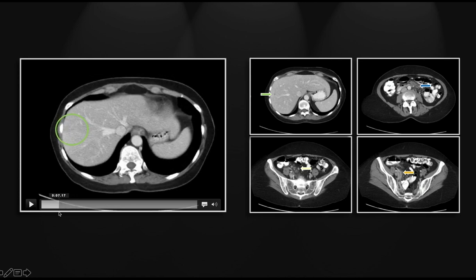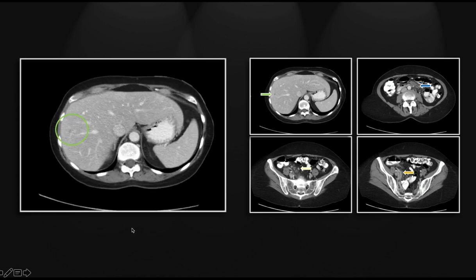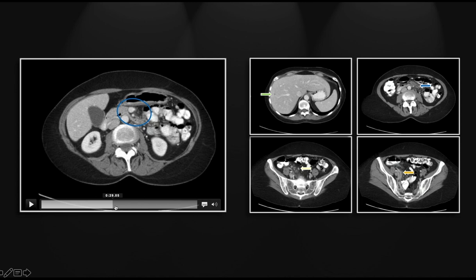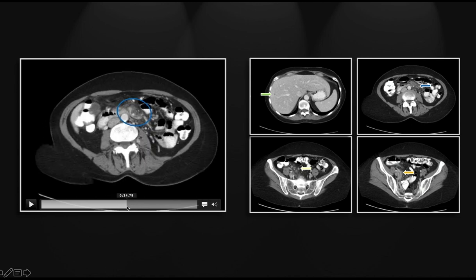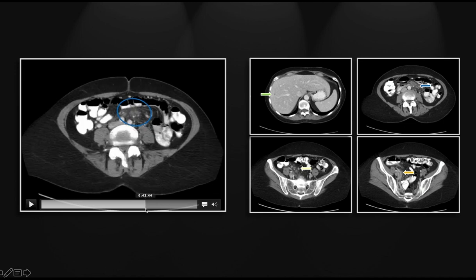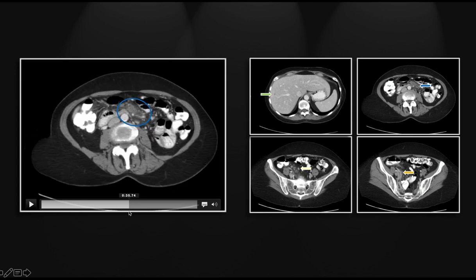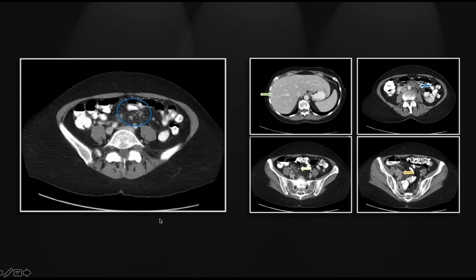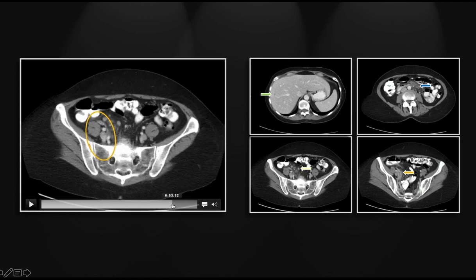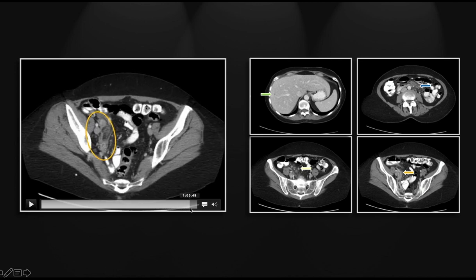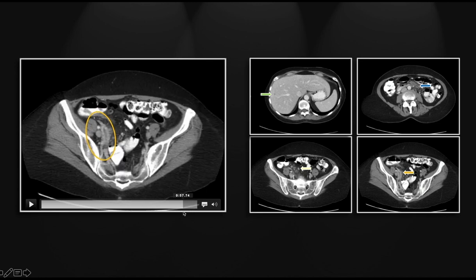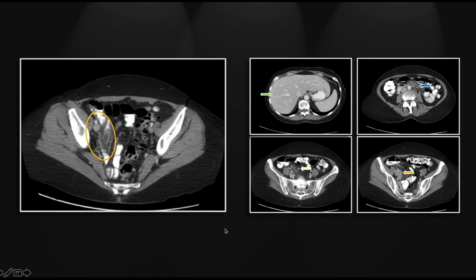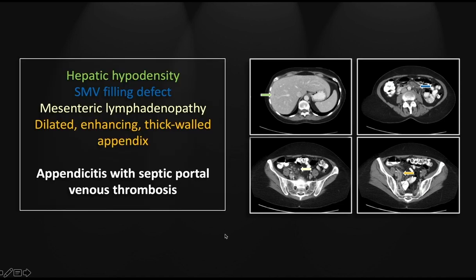We'll go down to the superior mesenteric vein — there it is, with a filling defect involving it and many of its branches. Now let's go to the pelvis and find that dilated, thick-walled, blind-ending appendix. That is a case of acute appendicitis with associated septic thrombophlebitis of the superior mesenteric vein and ultimately the intrahepatic portal vein.